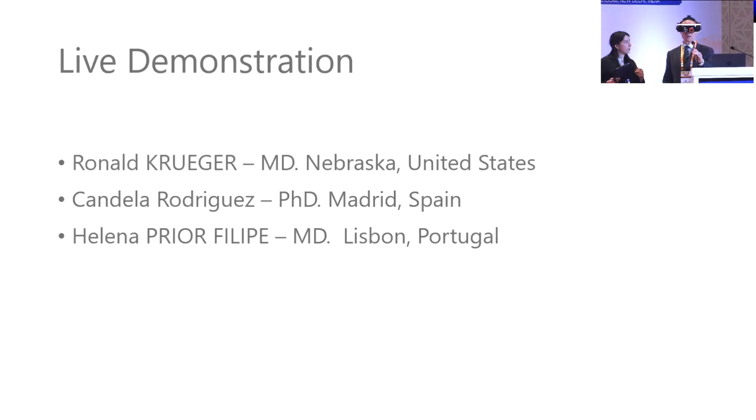Sure. So just to start, I have not had any cataract surgery. I'm a slight hyperope. I am wearing a contact lens that allows me to use monovision, so I've been used to monovision in the past. And right now I have a simulation that's giving me distance in both eyes with an EDOF, a Vivity. I can see the distance pretty well with no real distortions, and I can read pretty nicely all the way down. So I think I've got decent range with this. The near and far are comfortable.